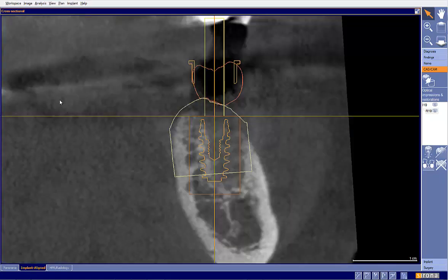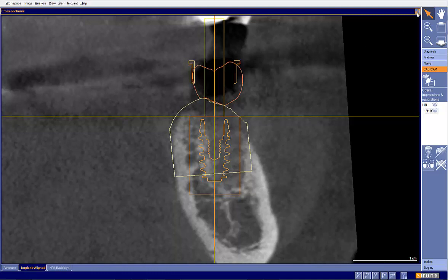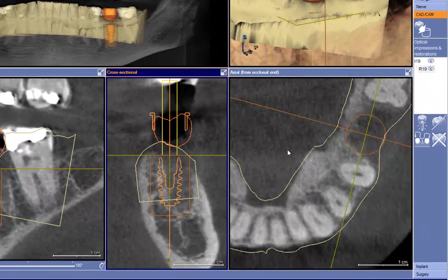Personally, depending on your comfort level with guided surgery, I may plan this a hair deeper and then, at time of placement, back the implant out, or not drive it all the way down to be able to see the bone level position. But that's based on comfort level here. I'd rather plan deep and then back it out in a case like this, especially when having the full stability isn't that big of an issue, since we're not going to be placing a provisional on there.